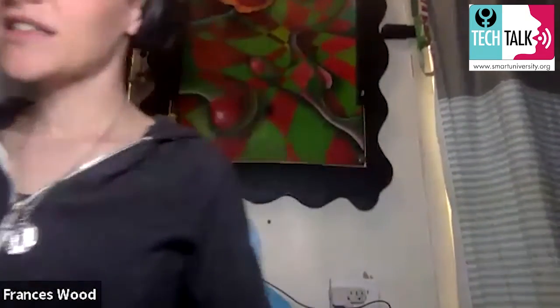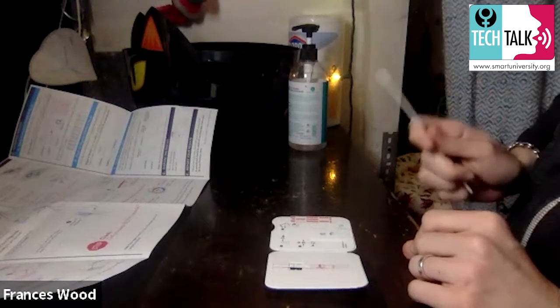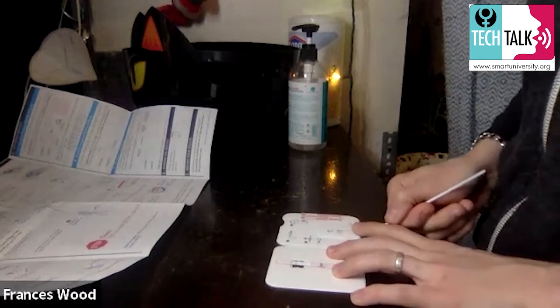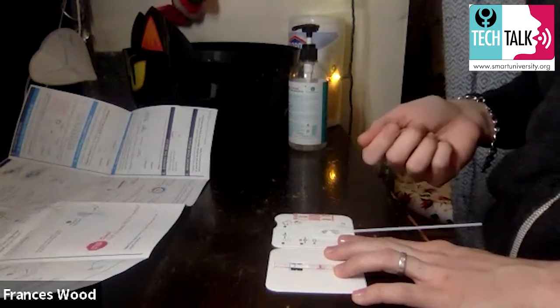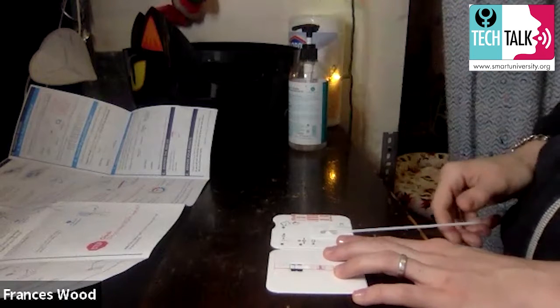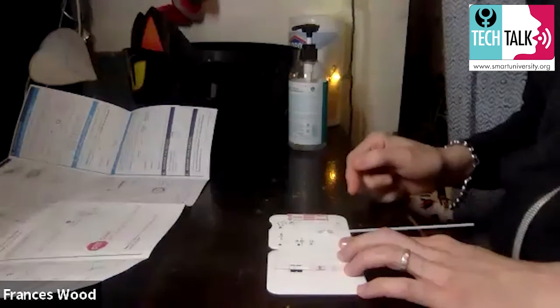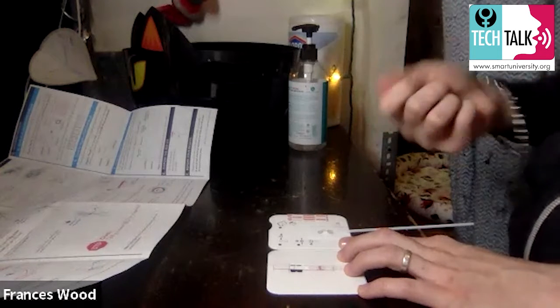Now we go back to our test card. Keep it flat — if I pick it up, it's just to show you; when you do it, keep it flat. Take the nasal swab and stick it up through the bottom hole of the card, pushing it until you see the tip coming up through the top hole. It goes behind that little middle section. Then — this is really important — turn it to the right all the way three times: one, two, three. That mixes your nasal sample with the solution inside. You can get false results if you don't do those three twists.